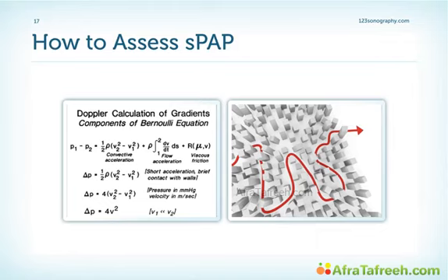But that's not the end of the story. So how do we get systolic pulmonary arterial pressure out of TR velocity? Okay, Andreas, now it's time that you explain this formula to us. Well, Thomas, I think you're kidding. It's been a long time that I've passed my A-levels, so I'm not going to resit them. In principle, this is the famous Bernoulli equation, and this considers a number of factors, such as convective acceleration, flow acceleration, and viscous friction. But fortunately, for us echocardiographers, we can simplify it.